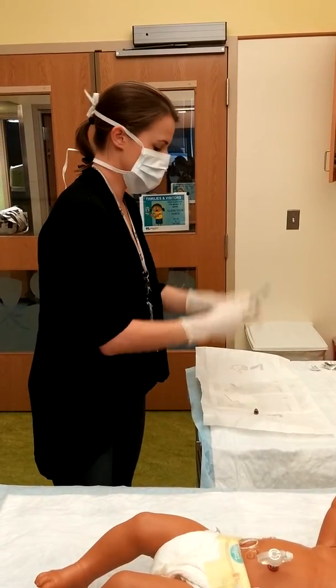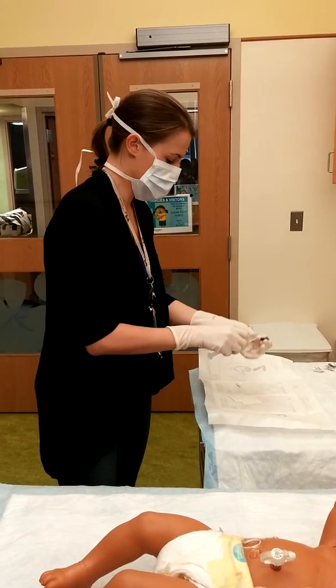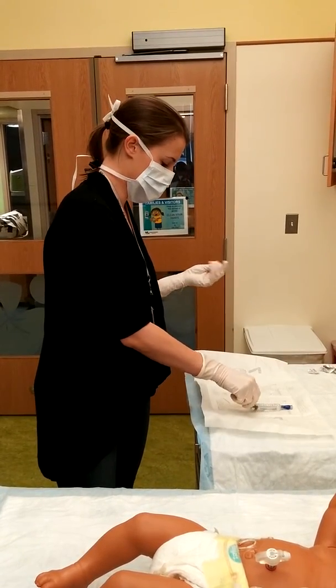Then you want to take your flush and you're going to flush your cap through until you see the saline come through.